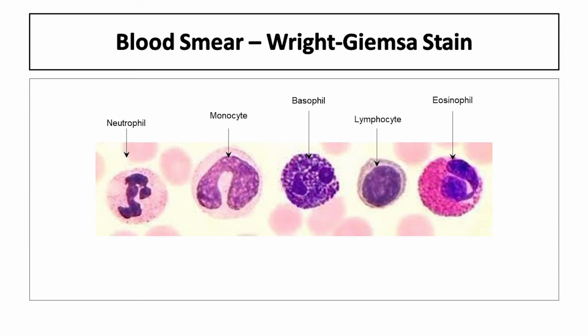Now, these are harder to find, basophils and eosinophils. They represent a very small amount of blood because usually they're located in specific tissues, mostly the cells that we think about that are related to allergies or more historically to parasites and things like that. So they're usually tissue specific, but they can be found around in blood. There's something like 0.4% or 0.1% of blood, depending on which one you're talking about.